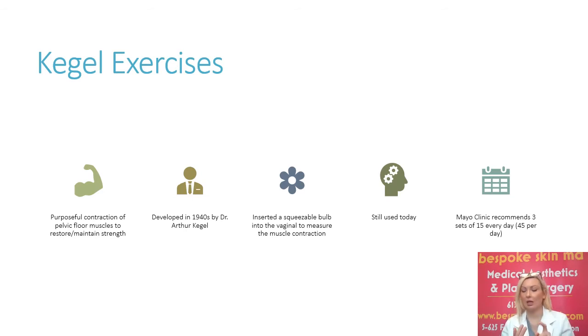You didn't talk about sex. You weren't supposed to like sex. And you sure didn't talk about incontinence. And if you did, that was just part of being a mom, and you were just supposed to accept it. But what Dr. Kegel developed was a device which was essentially like the bulb of a blood pressure cuff that we used to blow up a blood pressure cuff, and that was inserted into the vagina, and then women would squeeze, and you could measure, just like on a blood pressure cuff, how much contraction they were getting.